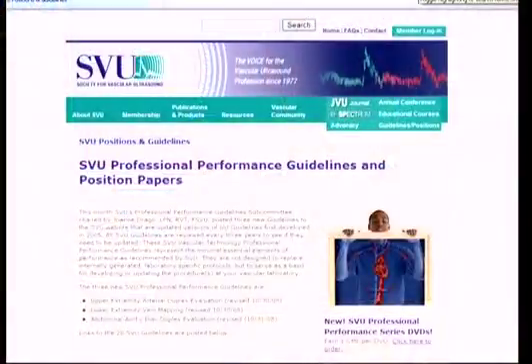I'll be providing a brief overview of the SVU Professional Performance Guidelines, and then Dr. Phil Bendick will provide a comprehensive presentation and demonstration of the Aorta Iliac Duplex examination. Dr. Bendick will then return to demonstrate these techniques on our patient model.